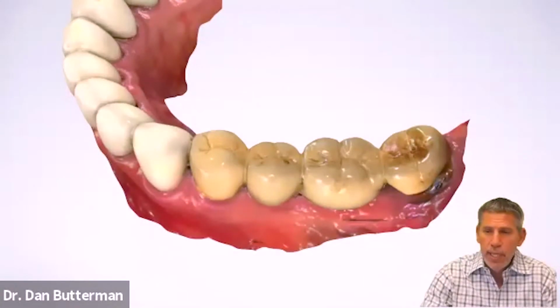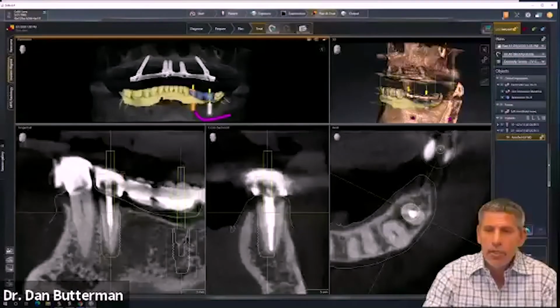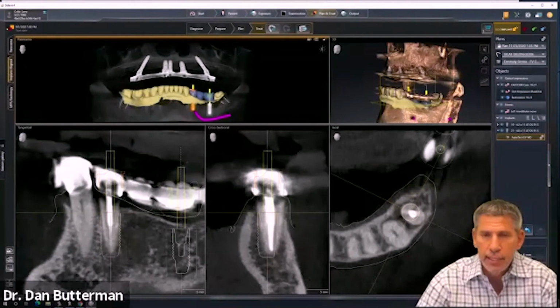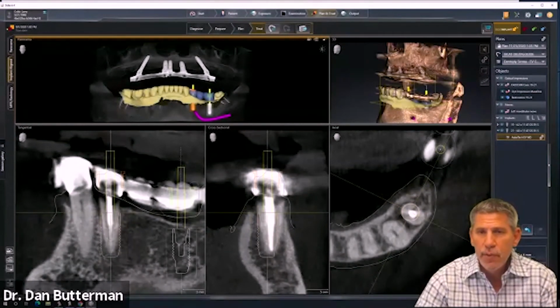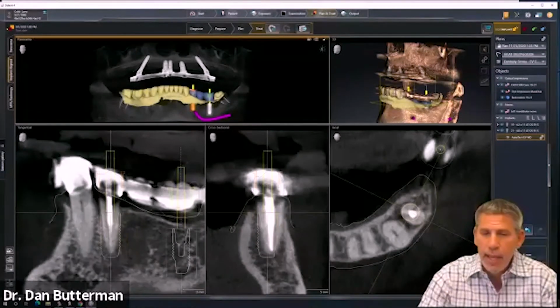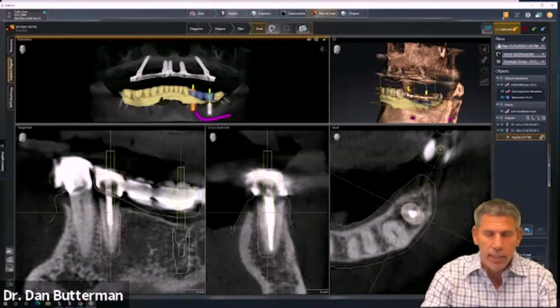So here's the workflow. We did a scan, and we can see his bridge from 18 to 21. I took that optical scan and his CBCT scan and sent them to CCAT, and I said, let's make a surgical guide and let's do the surgery. So they will virtually extract those teeth, including the mesial tooth number 21. They will plan and position the implant at site 19 where I was planning to do it, and 18 was just going to be extracted. We're just going to be removing that and not putting anything in that site.